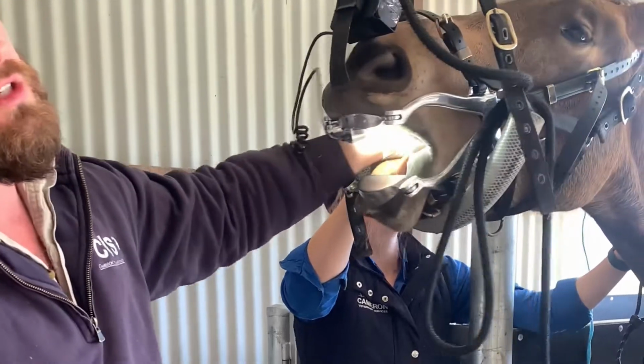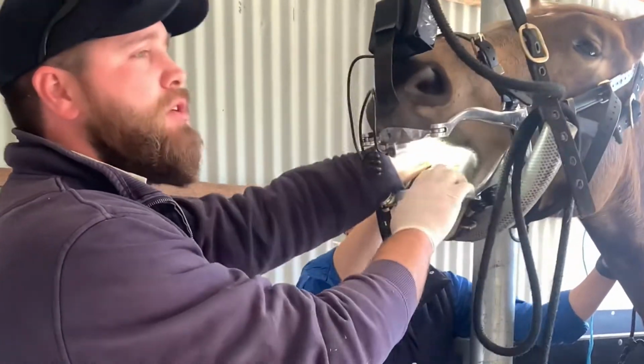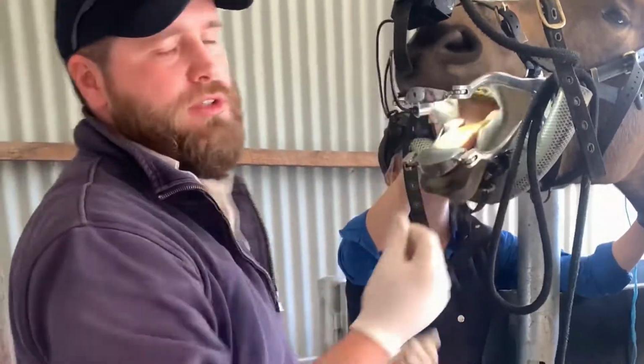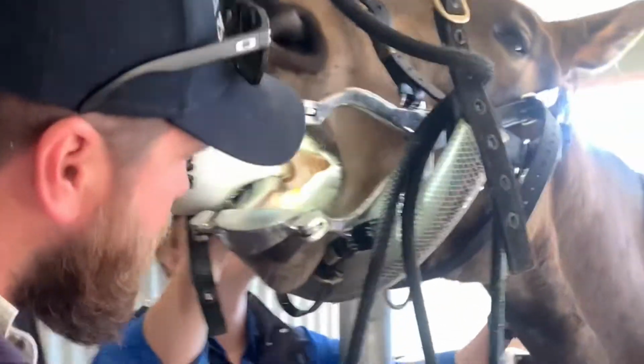I did forget to mention too, as part of an oral exam, you actually want to feel, because as well as look, you also have a good feel for those sharp points with your hands. So he's a little bit sharp, he's not too bad, and we'll float him up now and we'll be right as rain.